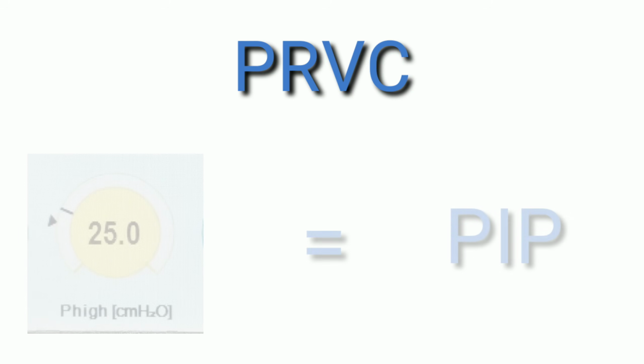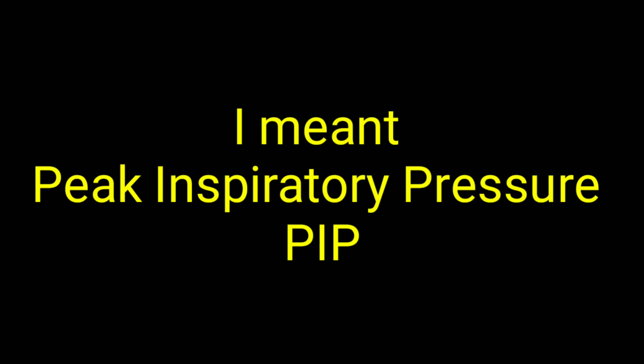If you're in PRVC, as you know, it's always trying to use the lowest pressure possible. So we would take the peak inspiratory pressure from PRVC to get your initial P high settings.